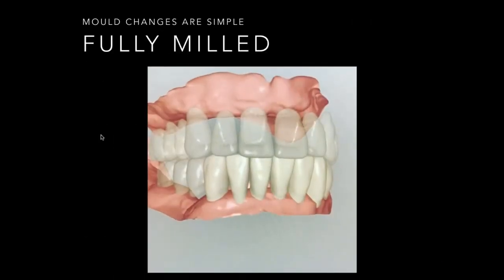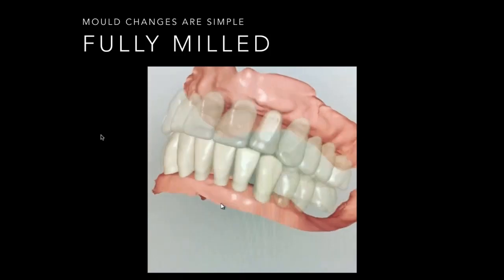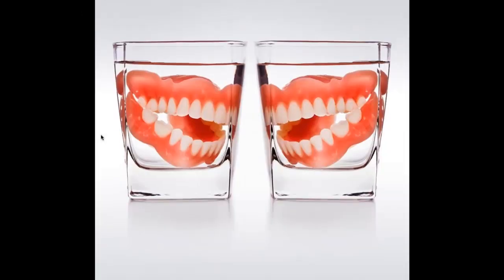This is the process for changing the molds by just clicking rather than having to switch out molds. And duplicating your dentures. First of all, when you order a duplicated digital denture, if you have already ordered that same denture, you can duplicate it nearly perfectly. As for the appropriate time to order a duplicate, I recommend not ordering it when you make your final order, but waiting until you've made sure before the patient receives the denture that it's going to work, that they like it, and then order the duplicate after that.